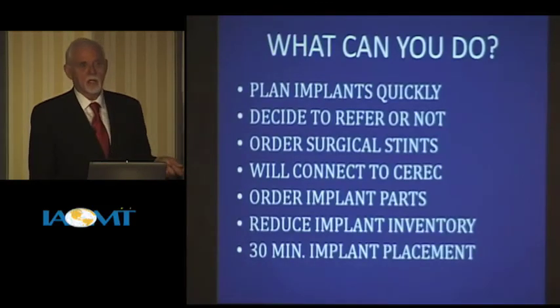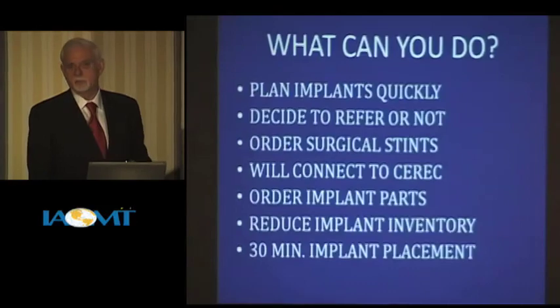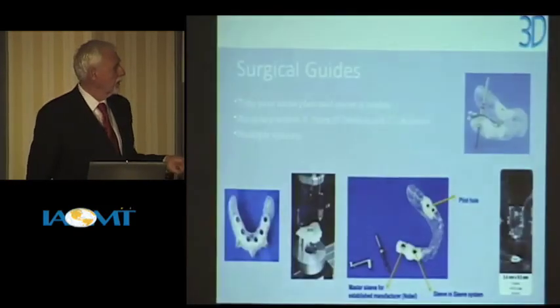I've heard a young guy lecture twice, tells me that he schedules an implant patient 15 minutes. I've actually seen him do it. It took him a little over 15 minutes. That's with a surgical stent, because there's no flap. Put the surgical stent in, zip, zip, zip. I've placed about 5 zirconium implants in the last, I don't know, 3 or 4 months.